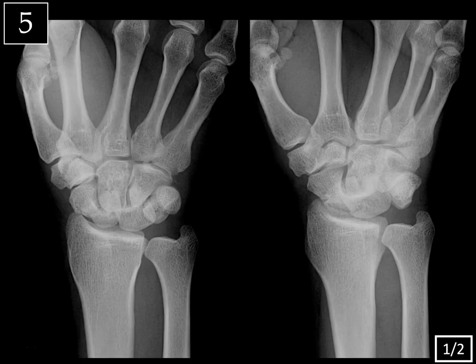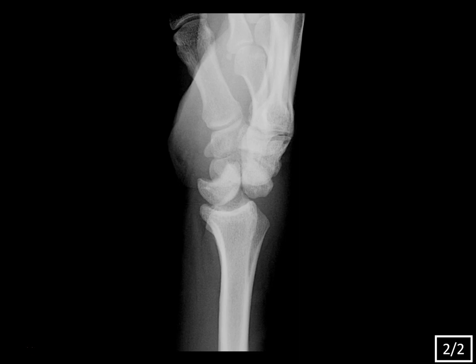We're looking at two frontal views of the wrist. There's a fracture through the waist of the scaphoid bone, but don't stop there — always look at the lunate as well. Make sure it has four sides; if it's ever triangular or has a candy corn shape on the frontal view, you worry about carpal disruption. It does maintain four sides here, however the proximal carpal row appears overlapping with the other bones. On the lateral view, you can see the capitate is dislocated dorsally, which explains why the proximal row looked disrupted. The lunate is still articulating with the radius.